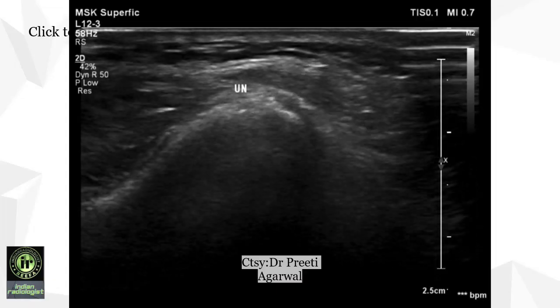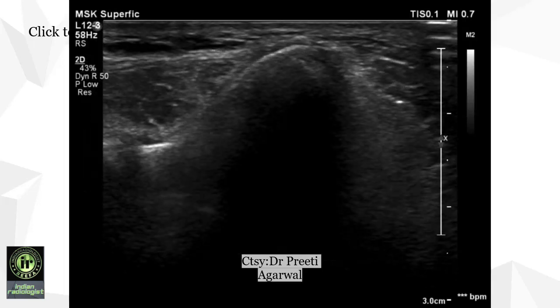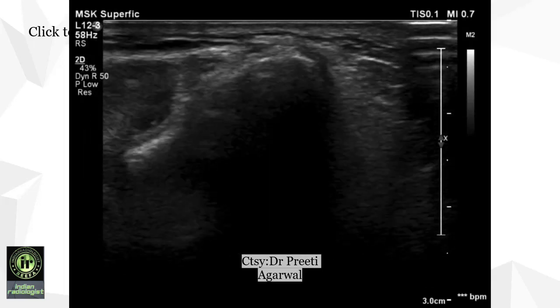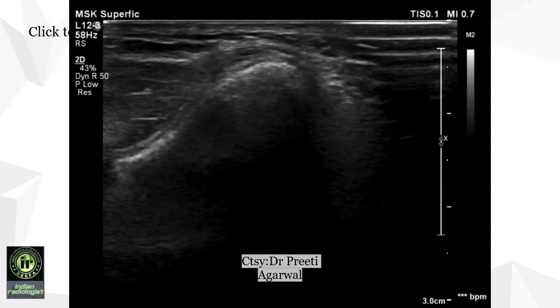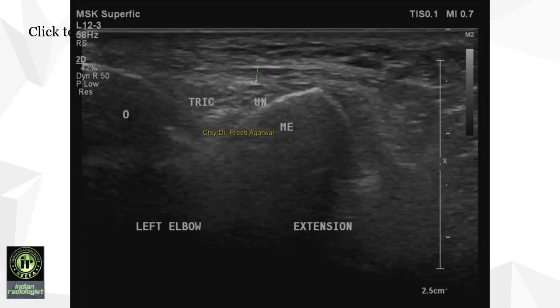The MRI findings are suggestive of cubital tunnel syndrome. We went on to do an ultrasound correlation. These are dynamic images at the level of the cubital tunnel starting with the elbow in extension and then in flexion. Static image at the level of the cubital tunnel of the left elbow in extension showing the normal position of the ulnar nerve, medial to the triceps and lateral to the medial epicondyle.